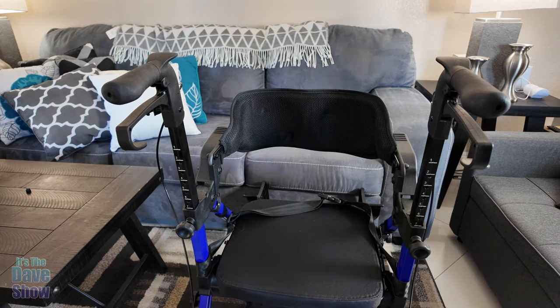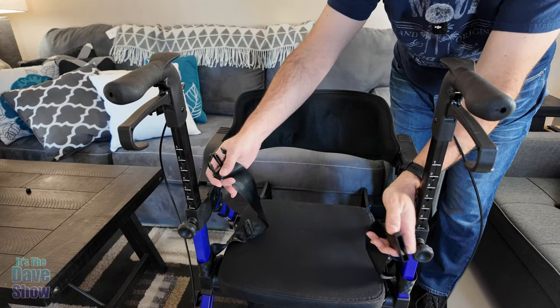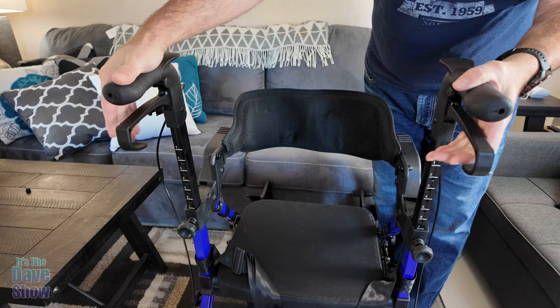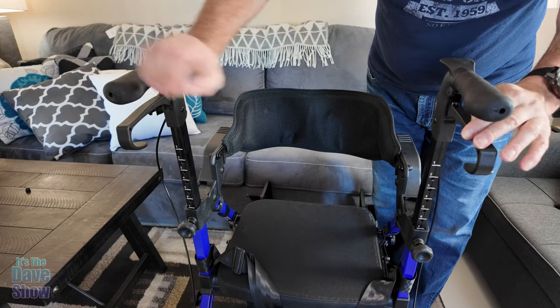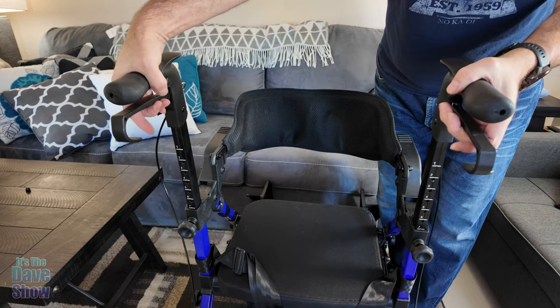Some cool features: this does have a seatbelt for safety for your passenger. We also have brakes on the wheels — useful for going downhill. It also functions as a lock: press it down and it locks into place.